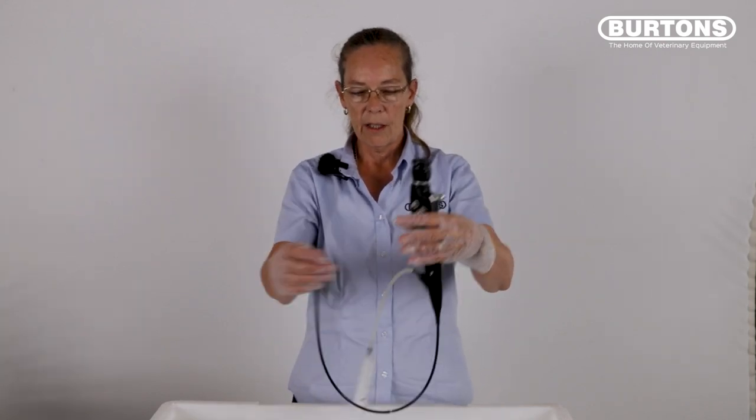To ensure your endoscope is dry before storing, take your syringe and flush some fresh air down through the channel of the scope until you have removed any excess water. The scope is now dry and can be stored hanging up.